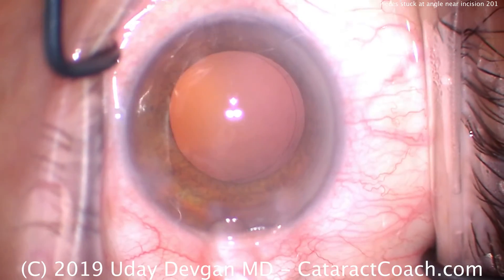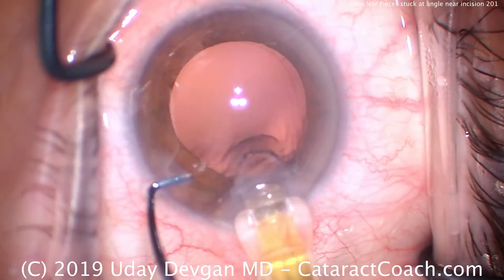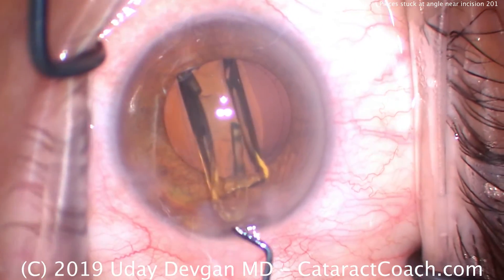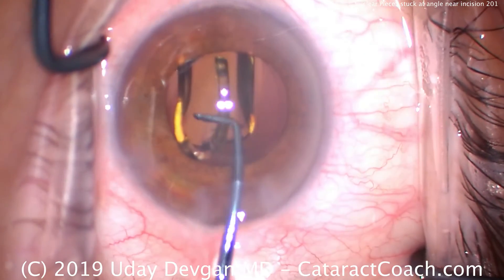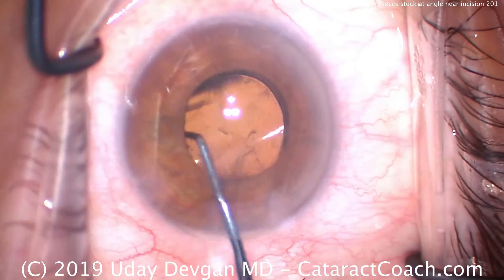There's a nice viscoelastic going into the capsular bag, a cohesive to fill it up. And we're going to deliver our IOL — a single-piece acrylic lens — going right there in the capsular bag. Looks great. We'll dial the lens into position. It's important that we get the lens completely within the capsular bag — both haptics and the optic in the capsular bag — that's important for long-term stability. And that looks great.